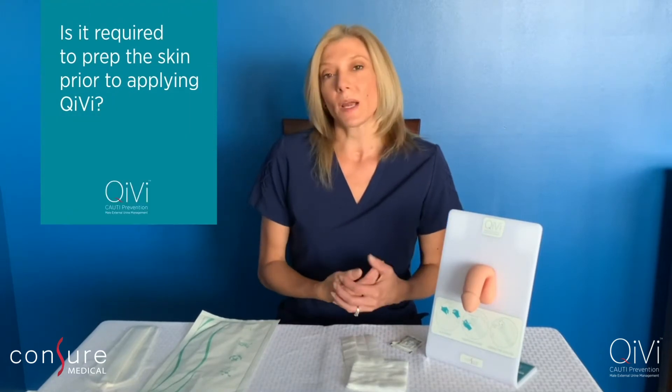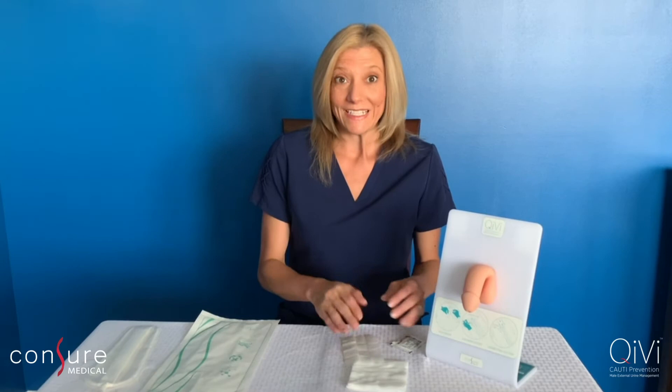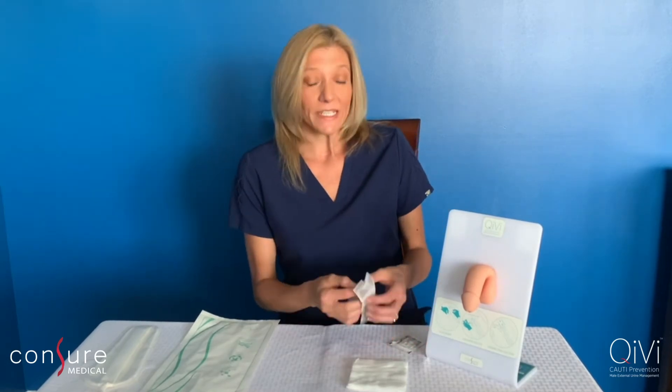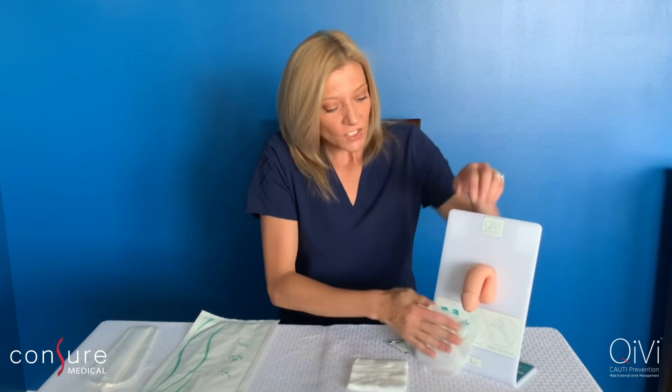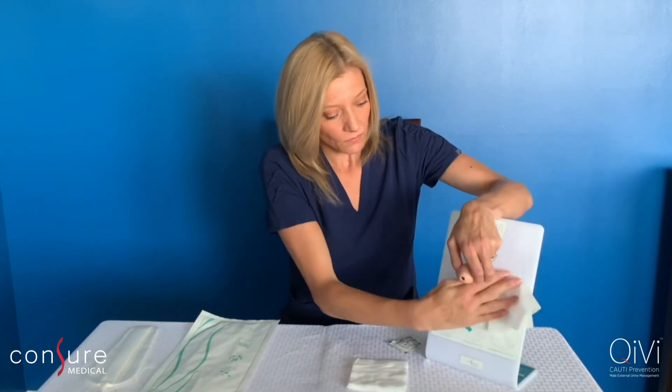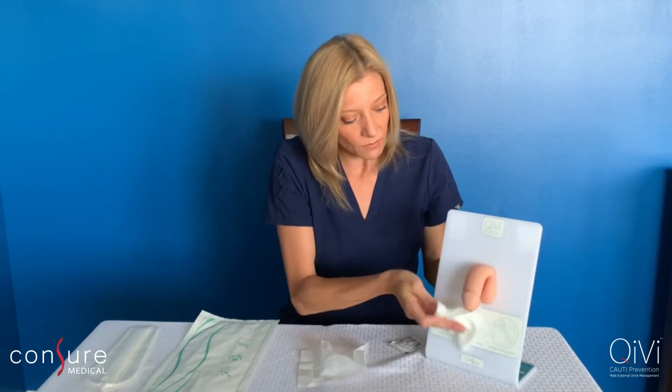I'm typically asked if you need to prep the skin prior to applying QV, and the answer is yes. You do want to clean the peri area prior to applying the device. You want to wash and dry the area, and that's going to ensure you get the most optimal adhesion possible.